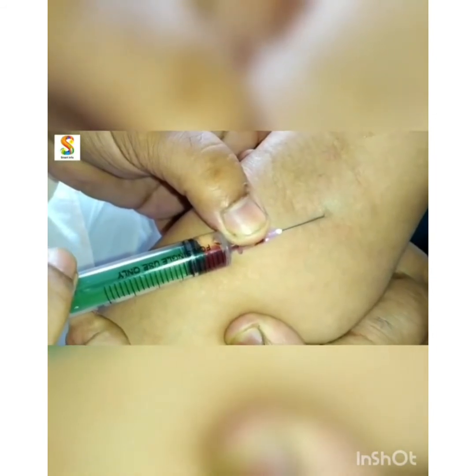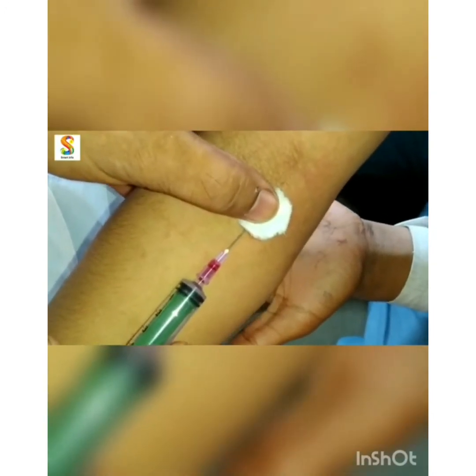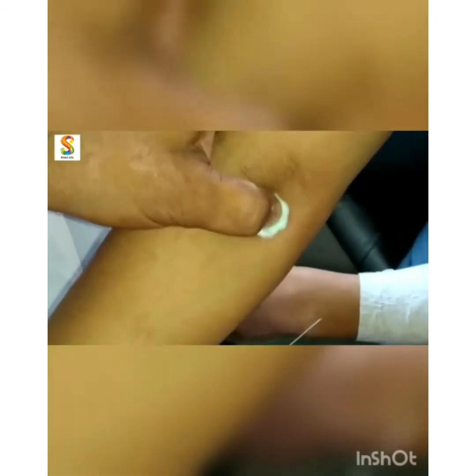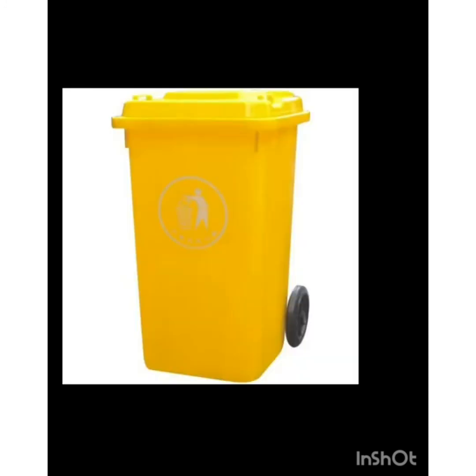Once you are done with that, put a cotton on the needle site, and then remove the injection slowly, and then exert pressure on the site where you have injected, so as to stop the bleeding. And after that, you can use the band-aid also. After this, you can throw the syringe and everything used into the medical dustbin, so as to make sure that no one can reuse your used injection.